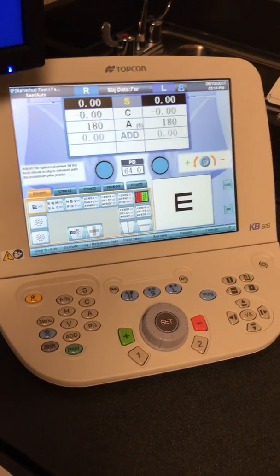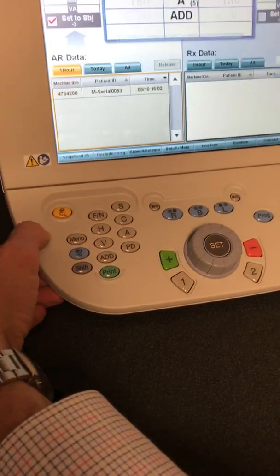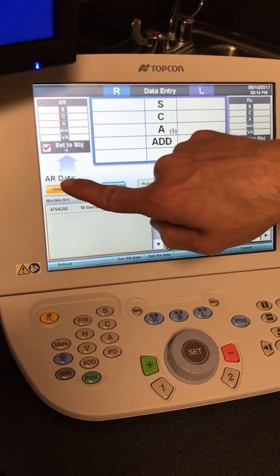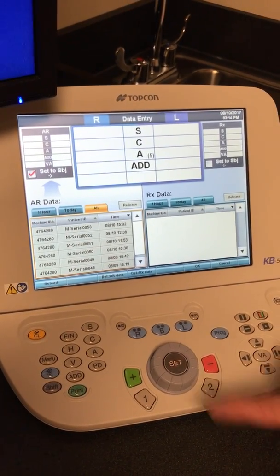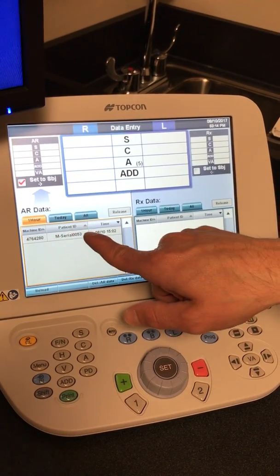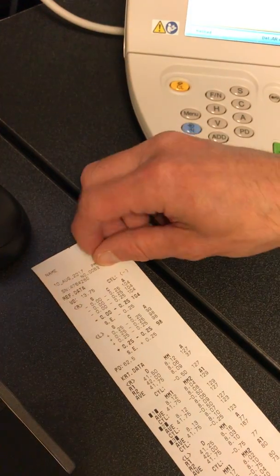Once the screen is set up, it will look like this, and to upload the autorefractor data, you have to hit this blue IN button. Once you hit that blue IN button, it gives you this information here. It will give you all the autorefractor data done in the last hour, all the ones done today, or all of them done from the beginning of time. So we keep it on the one hour, and match up the patient ID number with the one listed on the patient printout form.